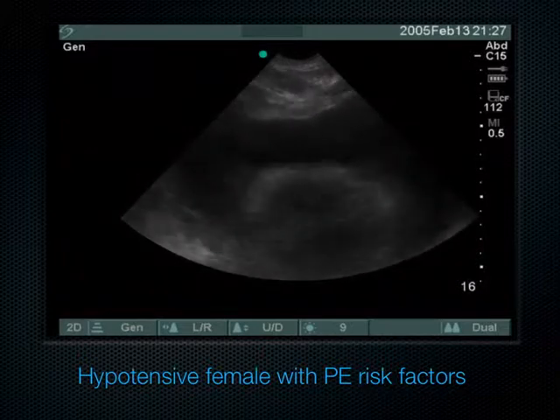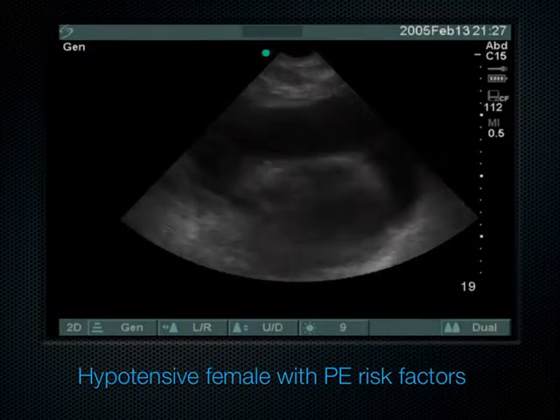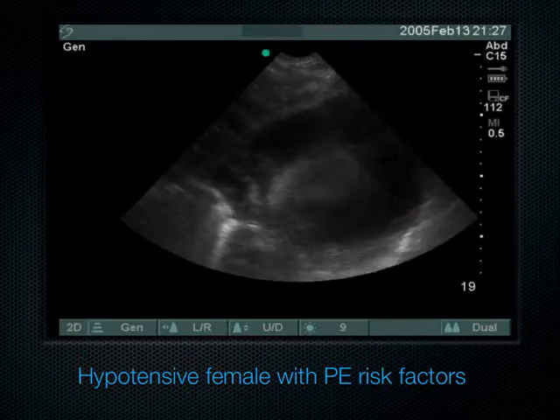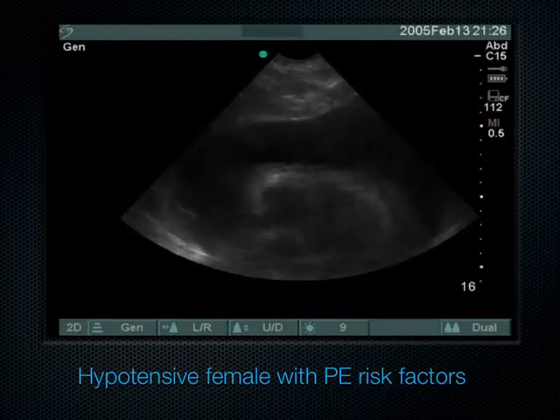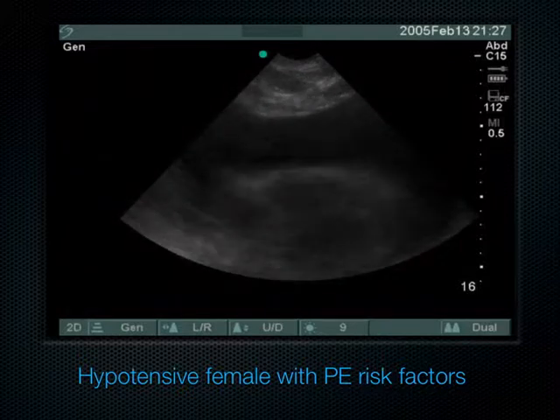Maybe it was just me being a poor clinician, not being able to figure out the difference between PE and tamponade in a hypotensive patient. Or maybe everybody would have struggled with that and been led down the wrong pathway. It really looked like PE to everybody in the room, but we were all wrong.